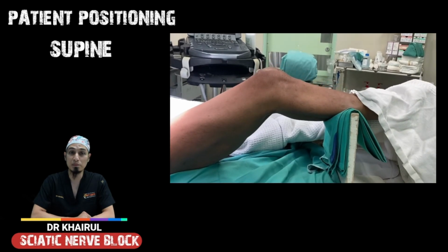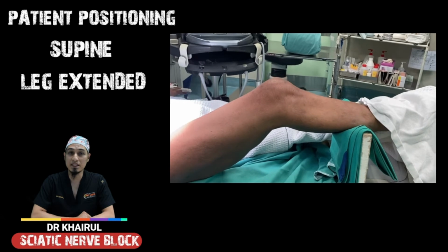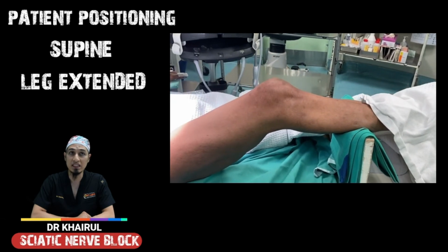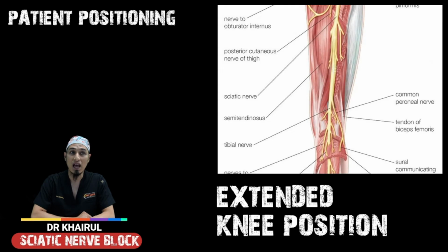Patient in the supine position. The ipsilateral leg is maximally extended at the knee with calf support. This is important because extended knee position tightens connective tissues of the hamstring muscles, making fascicles closer and compresses the sciatic nerve against a background of hypoechogenic muscle, enhancing its appearance.